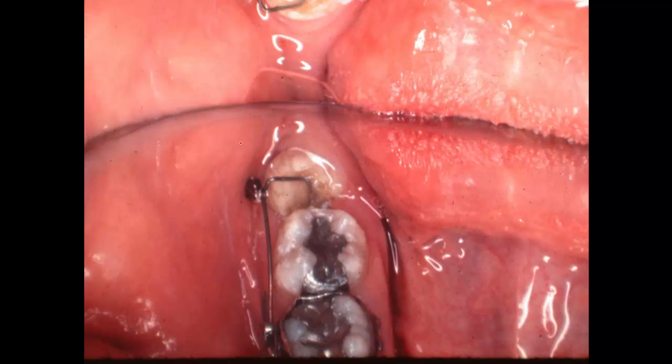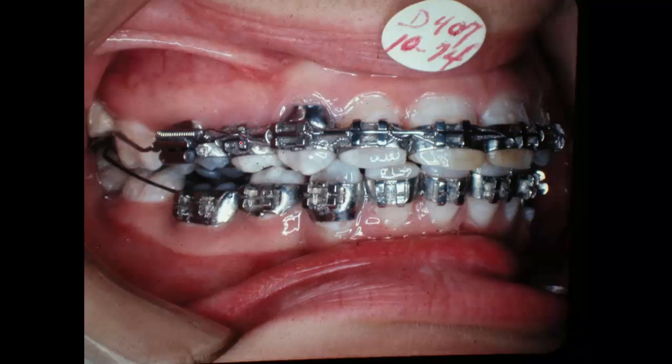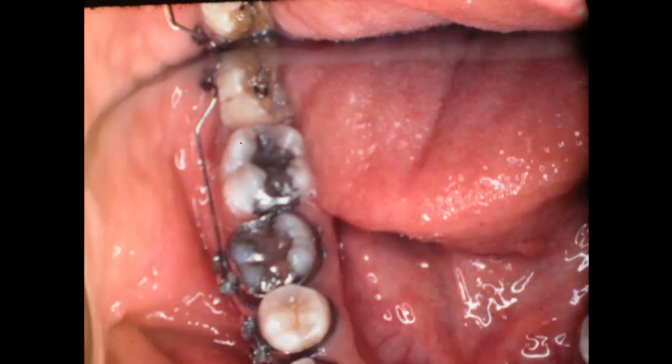Here it is from the top again, and some time skipped in here, but it took, I'm sure, several months for me to do that. But here, this is in 1974, and I had probably treated this girl for close to a couple of years. I don't remember exactly, but before I saw that, I wanted to keep that wisdom tooth, so we uprighted that at that time. Now you can look back and see the tooth is set up straight up, and then we kind of moved it forward. It'll kind of move forward on its own, and this is a 6-year molar. I've got several views of it. So this is where I really learned how to do this kind of thing.